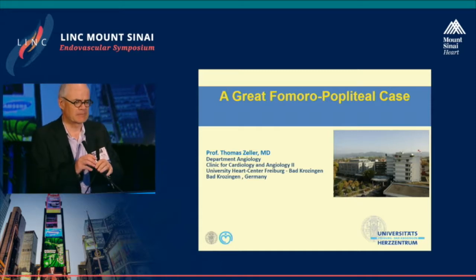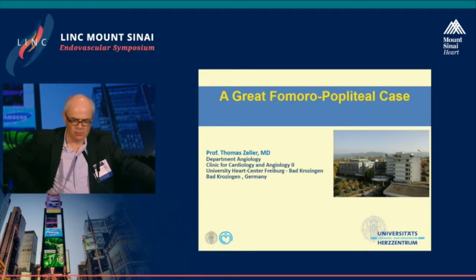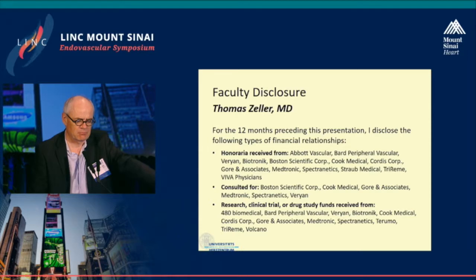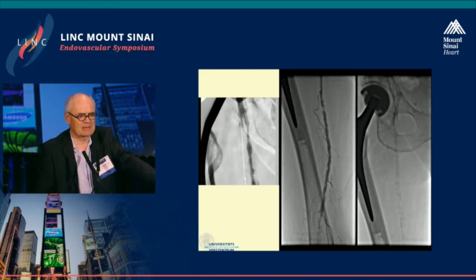Well, I would like to share with you a case which I did just a couple of days ago. It's nothing spectacular like Andre is doing every time when he's using retrograde access. It's more or less an everyday case showing the use and the benefit of a new technology, which I will not yet disclose. So this is the baseline angiographic finding.